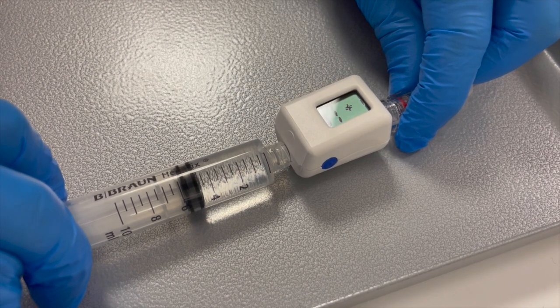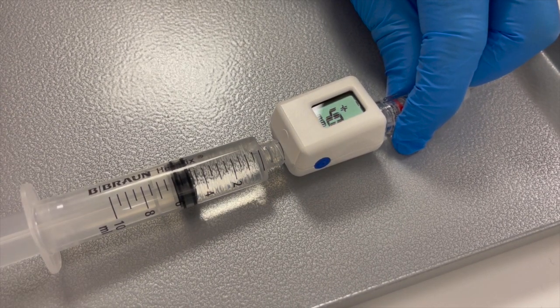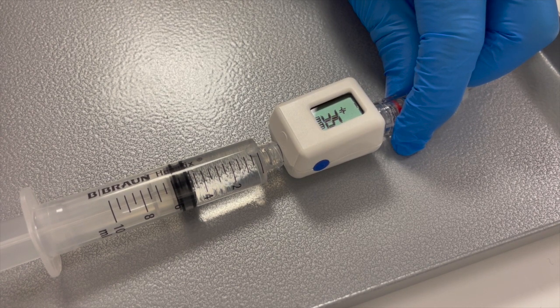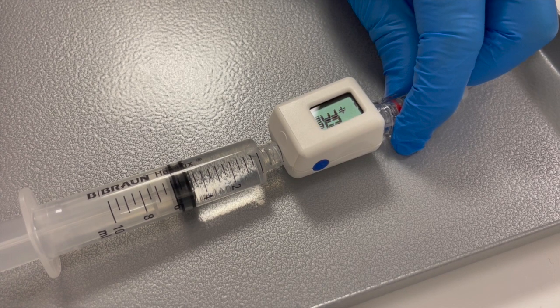Again, flush the manometer. As you will note, the pressure readings are high and then settle down slowly over the next 60 seconds or so.